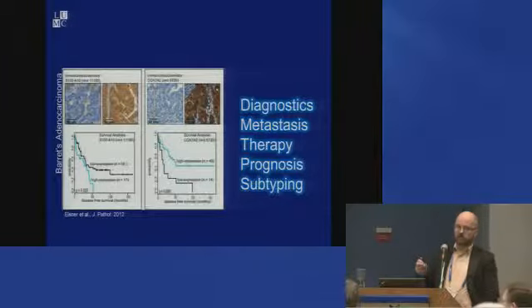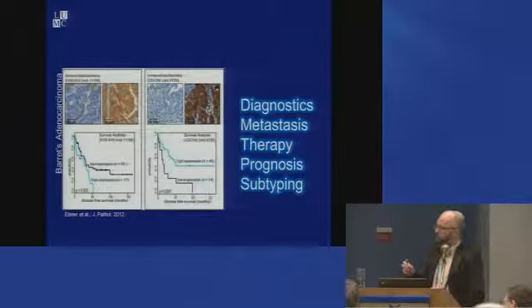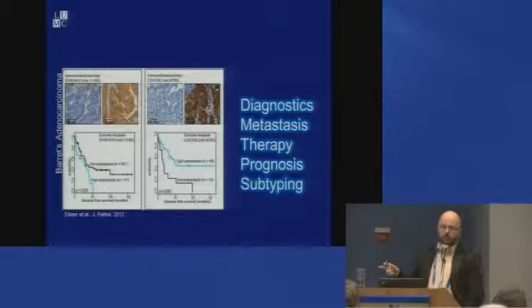And basically, imaging mass spectrometry led to the identification of multiple proteins which were associated with survival. And here we just see them here. Low expression of this S100A10 basically was associated with better survival, and the COX7A2 high expression was also associated with better survival. Essential component, you always have to basically validate these identities.